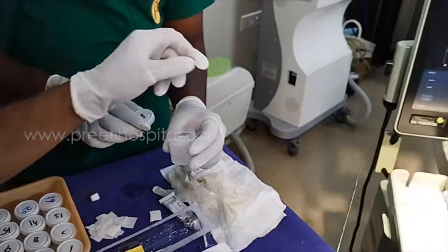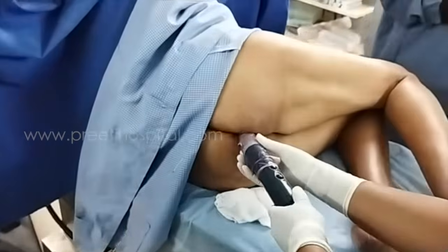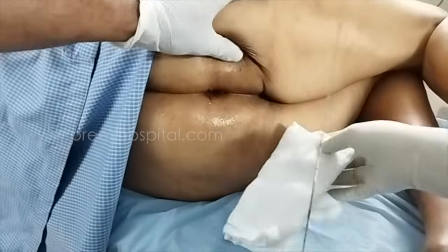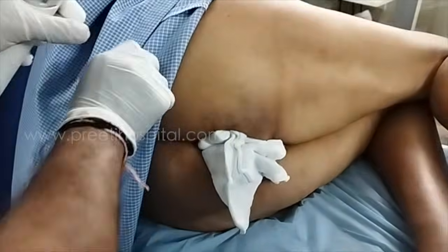Thank you very much, Soundarya. Now okay, when you insert you wanted to check for bleeding. Can you show here? Is there any bleeding? We will show if the bleeding is there. You wanted to keep for some time. No bleeding. So here no bleeding. Very well done. So we will keep a pad for some time.